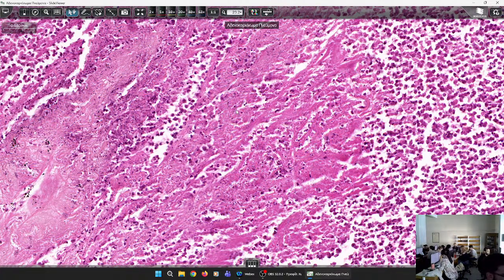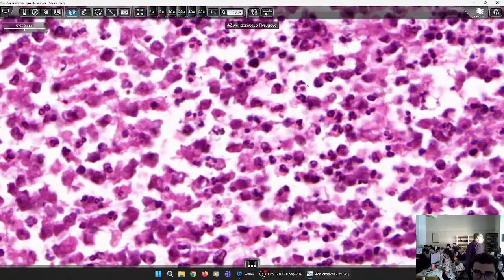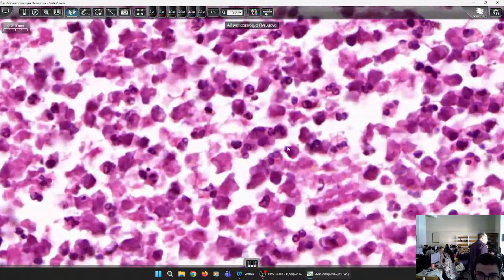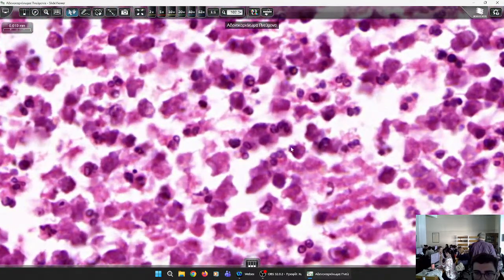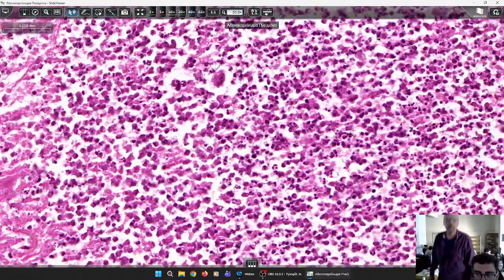What is this area where you see no structure and you see just inflammatory necrosis? This is a necrotic area. And you have the acute inflammatory infiltrate, which is not to be confused with the immune response to the malignant cells. This is something different. This is an acute phenomenon that caused the accumulation of neutrophils. However, it is common in cancers.